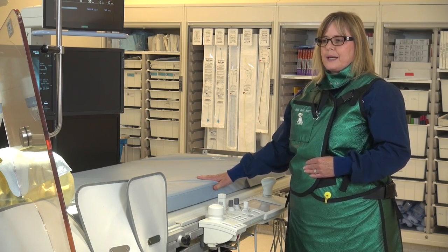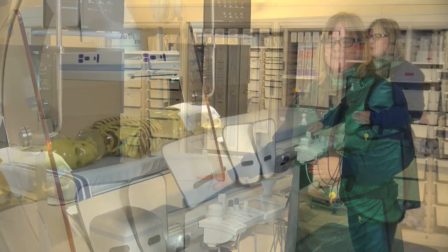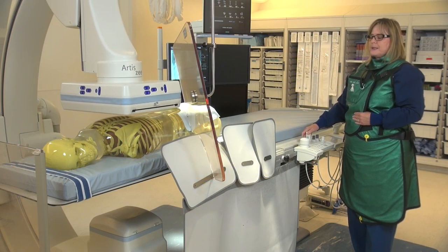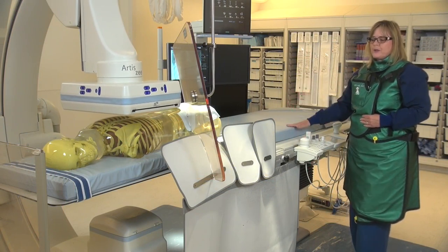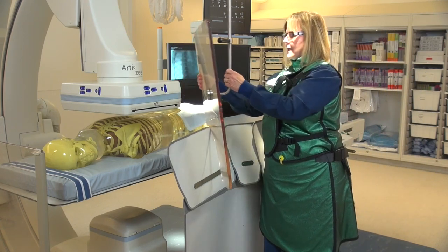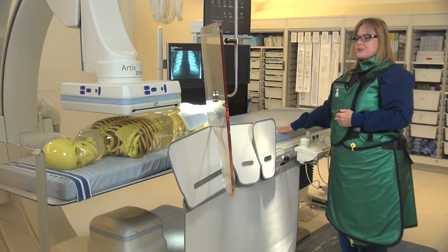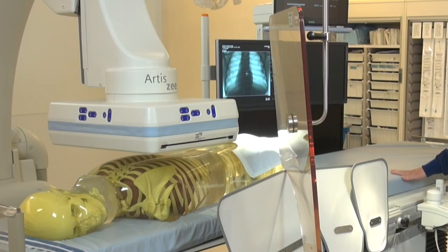By doing that, we'll be cutting the dose to the patient by 50%. We want to make sure that our image detector is close to our patient. This will help with dose savings to the patient, but it'll also protect our physicians and us as the technologists working next to the physicians from the radiation dose we're getting through scatter from the patient.